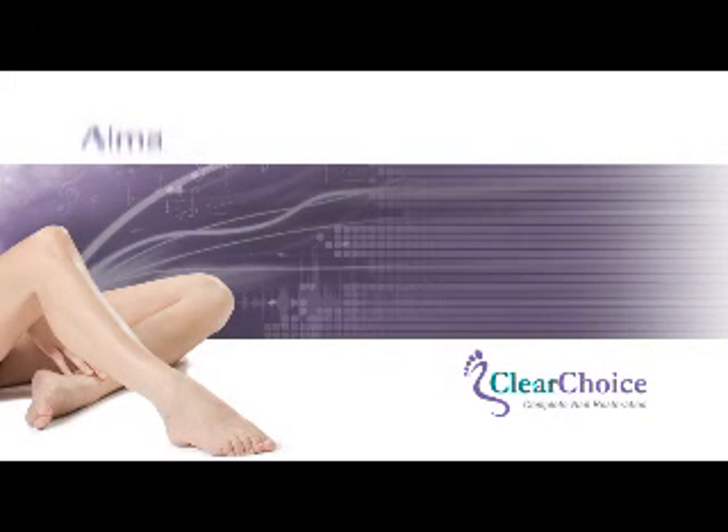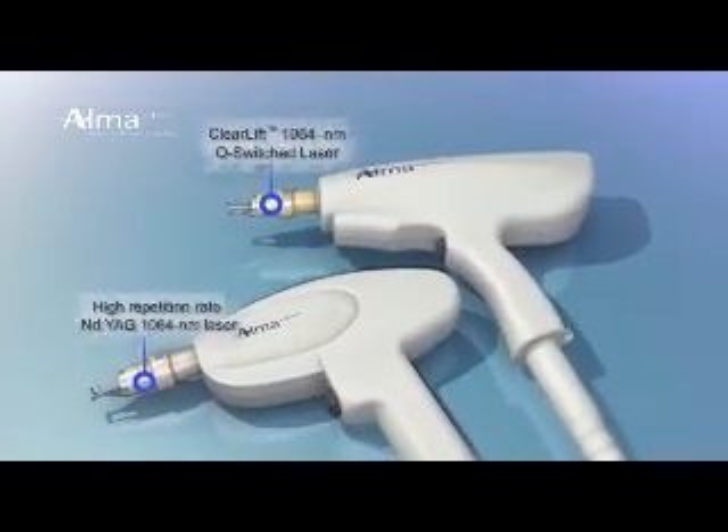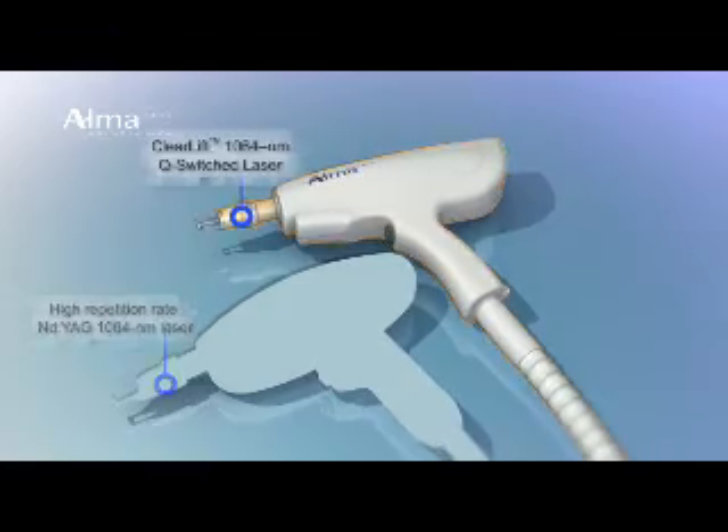Introducing ClearChoice by Alma Lasers, a unique platform that features two distinct laser modules providing added versatility in the fight against nail fungus.